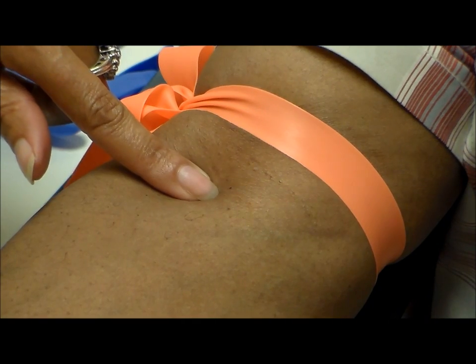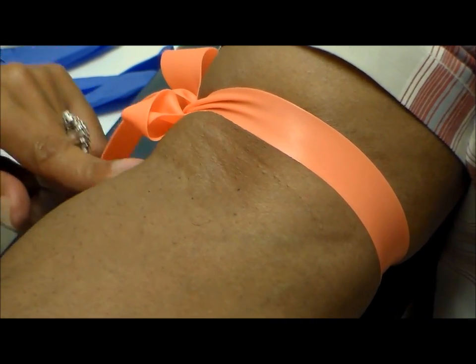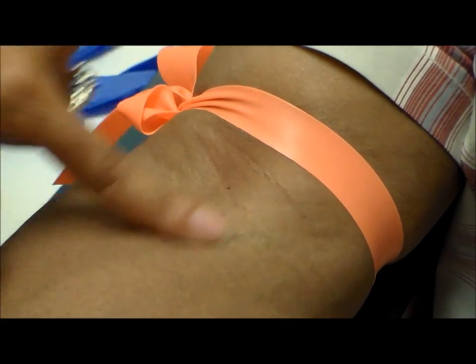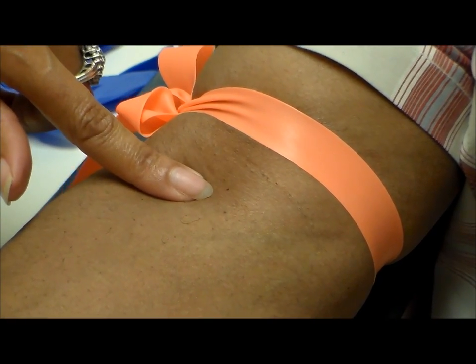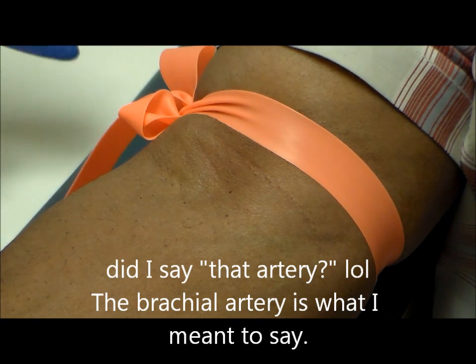A lot of the steps you are not going to see because my hands are clean and I did all the necessary precautions prior to this point. And of course you can see I am checking the median, the cephalic, and of course the basilic, which is over that artery. So of course I always choose the median.